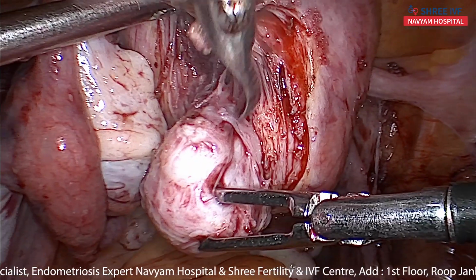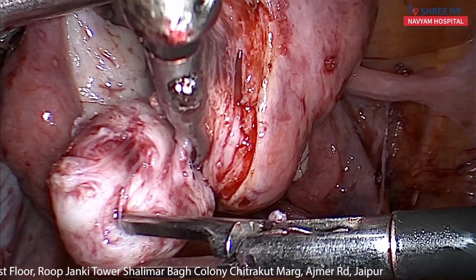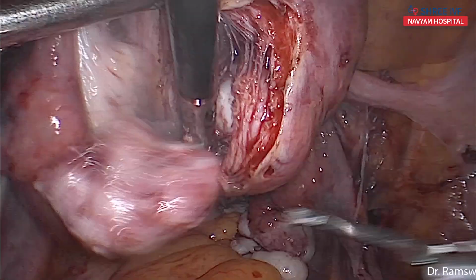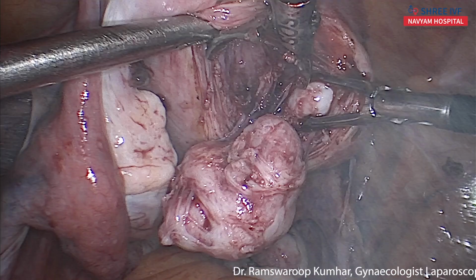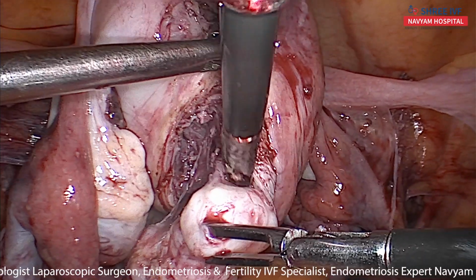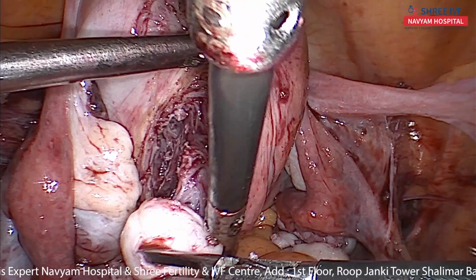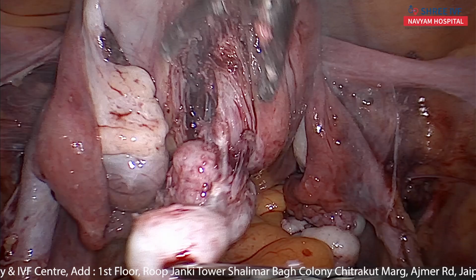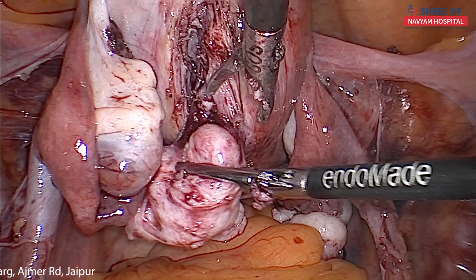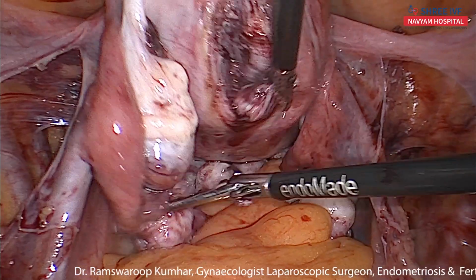You can see the use of blunt dissection by the scissor itself. This is the trick for blunt dissection. Just dig inside and open, dig inside and open, and then cut the remnants of the fibers. This is number 7, and this is number 8.